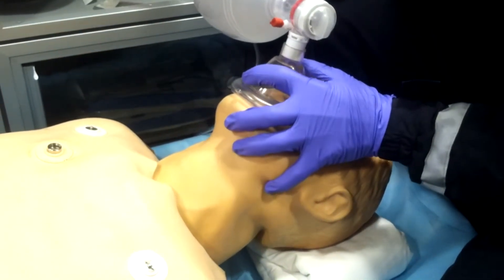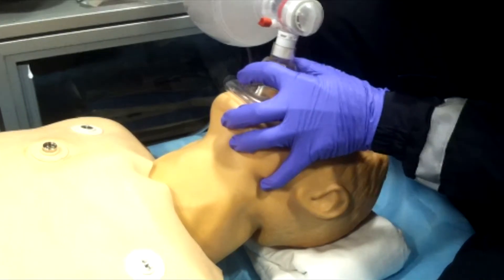We're going to pause early to talk about what our first responders did. You walk up on scene and this is what you see — they're bagging this patient. The patient is properly positioned: the oropharyngeal and laryngeal axes are all in line. For adult patients, they have a sheet or pillow folded underneath the patient's occipital lobe, which puts all these axes in line as soon as you displace the mandible upwards.